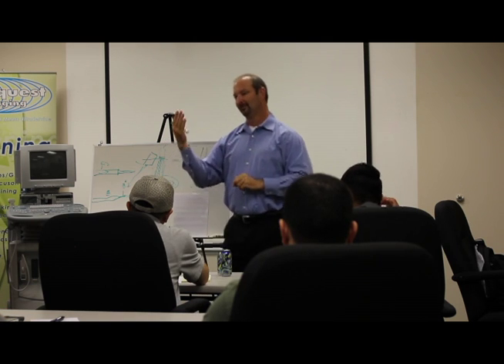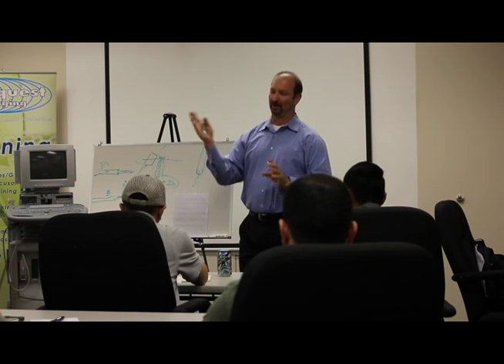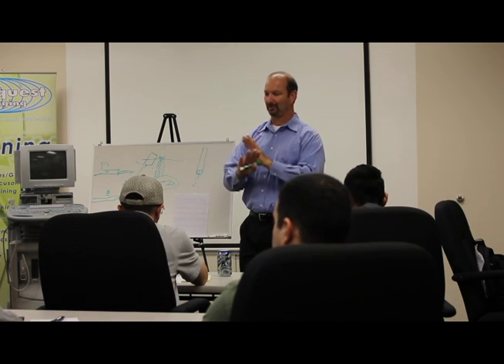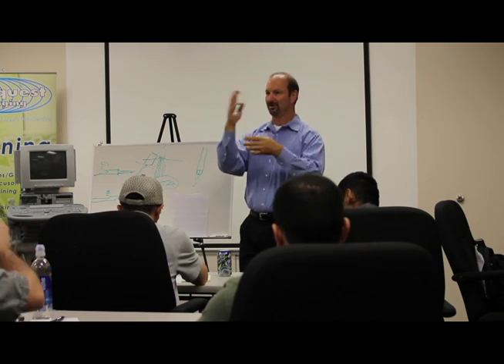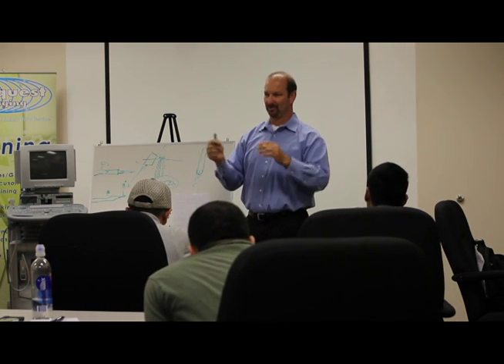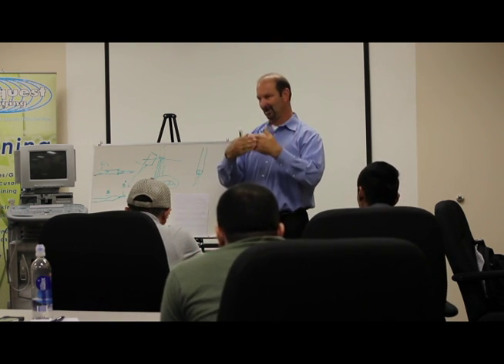So, a lot of times you'll see red and blue are the two colors we like to use for our color Doppler. You'll get orange and yellow and all of this. That's aliasing, meaning we don't know which direction it's going. The information just got cluttered.